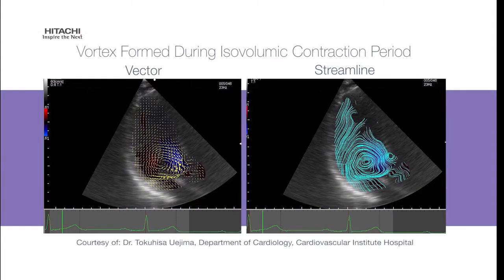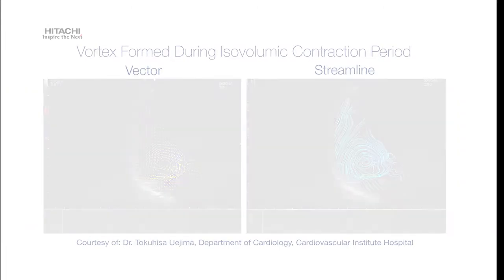IVC vortex. Examining a vortex during the isovolumic contraction period illustrates how the vortex aids in the formation of proper blood flow in the heart by preventing flow separation.